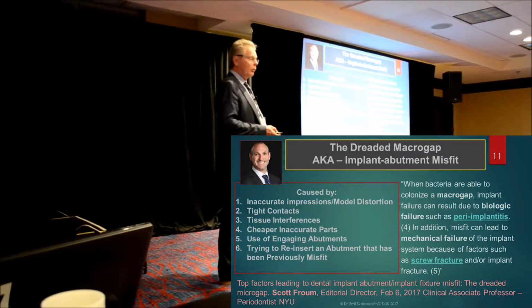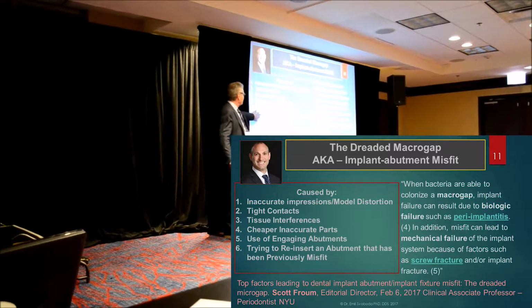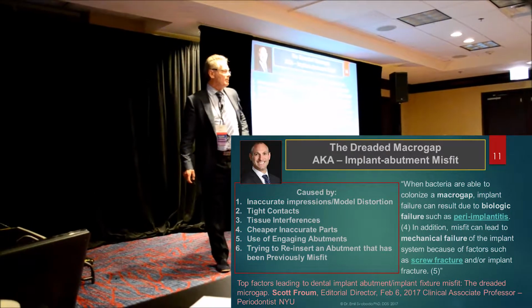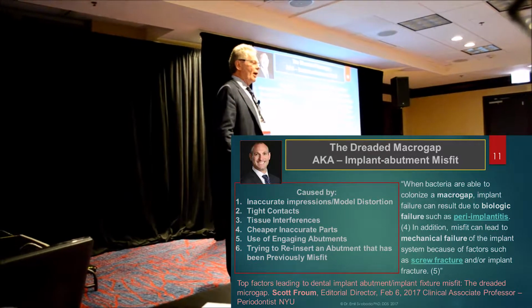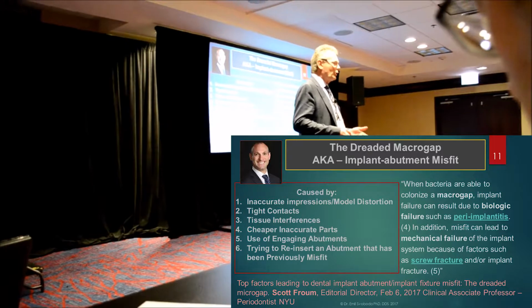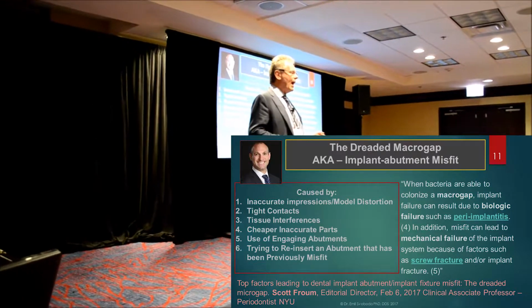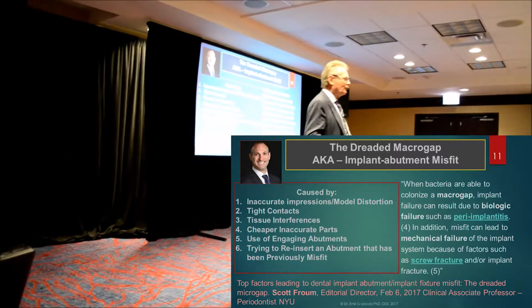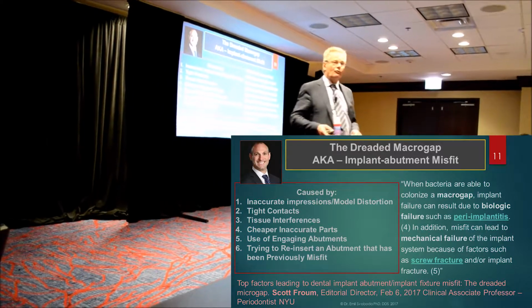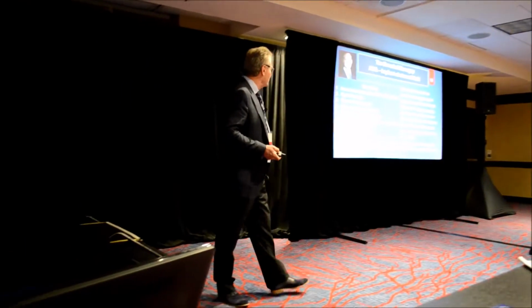It's all done in vitro when they measure how accurate things are. And he actually brings up the idea that if you have a misfit in the beginning, trying to take it out and reinstall it isn't going to fix your misfit, because you might have created a distortion at your connection. Or how many patients do you have that had a loose screw and didn't come in for a year? What do you think the top of the abutment and implant has been doing for a whole year? Right? It's not good, I can tell you that.